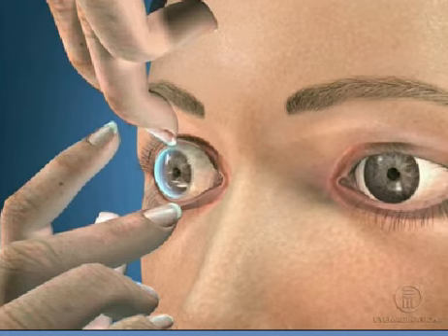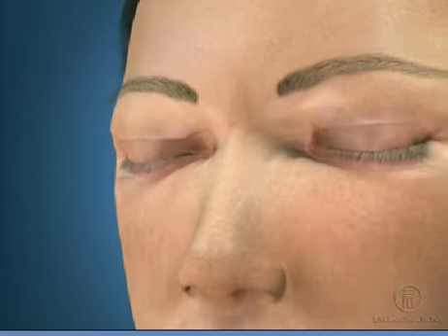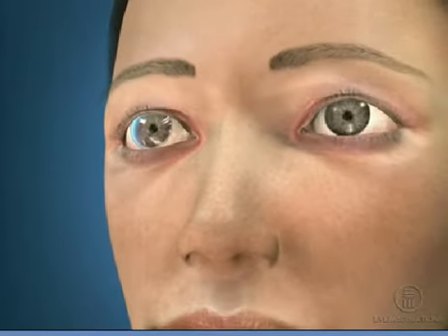Then slowly release your eyelid and close your eye for a moment. Blink several times to center the lens on your eye. Repeat steps 1 through 4 to insert your other lens.